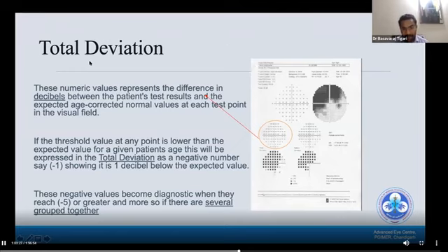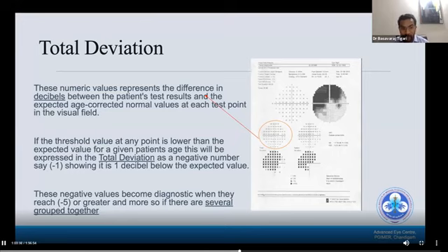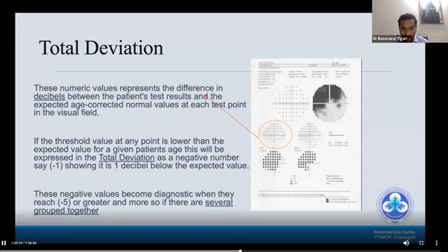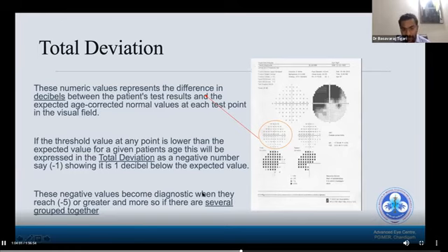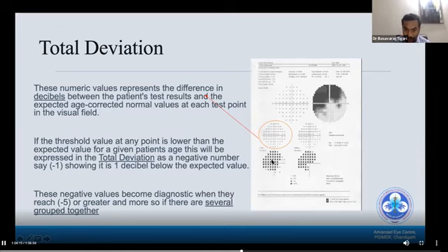Total deviation: these numerical values represent the difference in decibels between the patient's test results and the expected age-corrected normal values at each test point. If the threshold value at any point is lower than expected for the patient's age, it is expressed as a negative number — for example, minus one means one decibel below expected. These negative values become diagnostically significant when they reach minus five or greater, especially when several are grouped together.